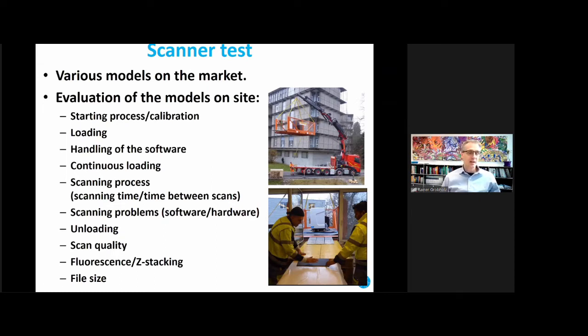And the workflow with the scanner is not the scanning process itself, but it's the whole workload, starting process and calibration, loading, handling the software. What about the loading? What about the scanning process itself? What about the scanning time, which is mostly advertised by the vendors and runs between 30 seconds and 1 minute, and the time between scans, and the scanning problems, software or hardware?